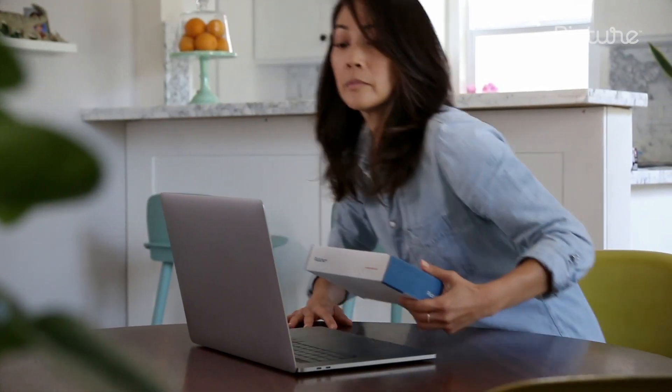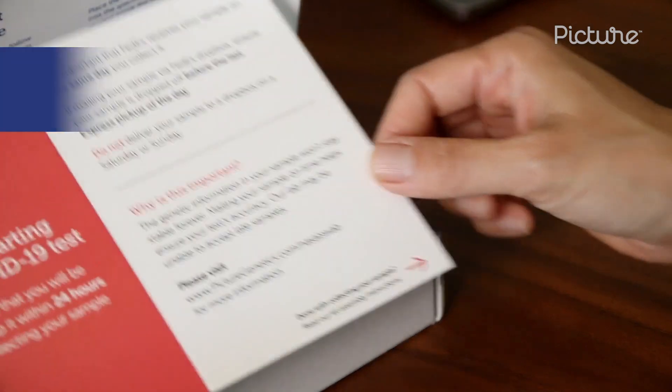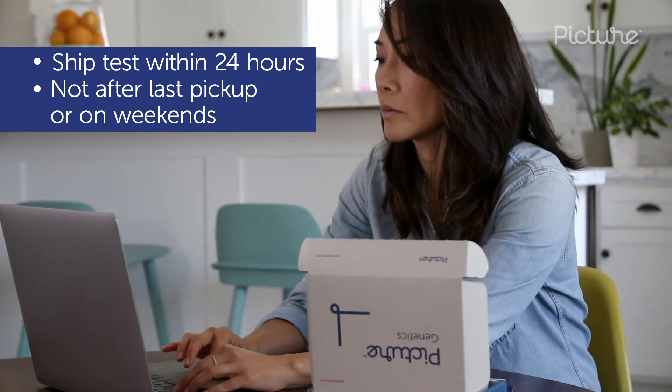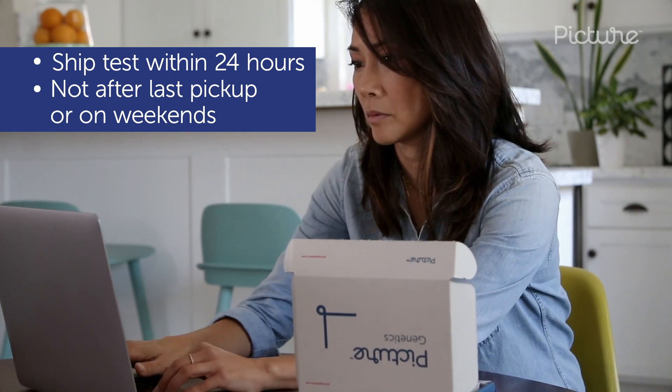The first thing you'll want to do is activate your test, but only if you're prepared to ship it within 24 hours. Due to the sensitive nature of these tests, the lab must receive them as soon as possible. Check your local FedEx Dropbox availability and be mindful not to ship after the last pickup of the day or on the weekend.